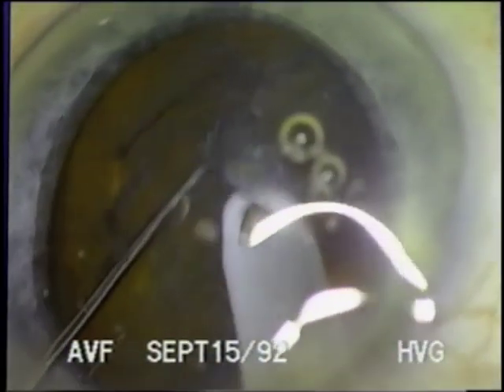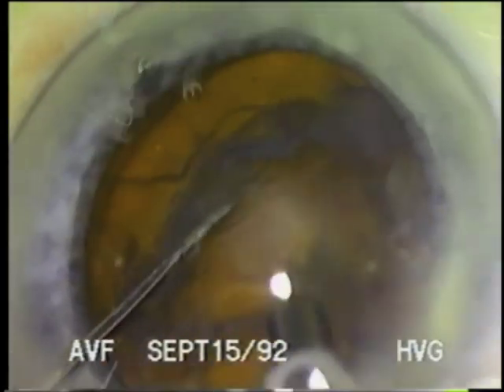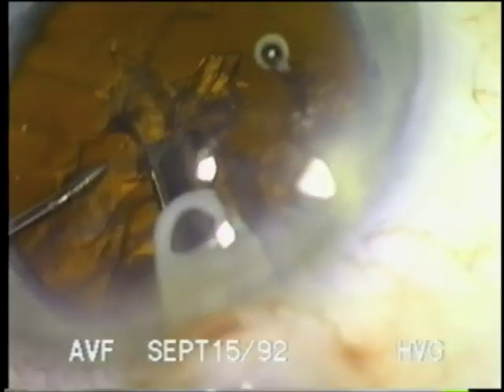With this technique, it is not necessary to pre-groove these moderate sclerotic lenses to weaken the nucleus. With these radial cleavage planes, fractures are easily accomplished without any pre-grooving. As illustrated here, even without hydrodelineation, the nucleus has spontaneously separated from the epinucleus, which was fractured along with the nucleus. The epinucleus is easily removed using low flow and vacuum with the help of the second instrument to maneuver the material to the phaco port.